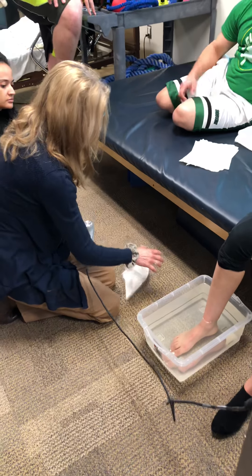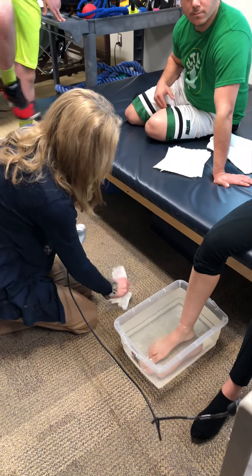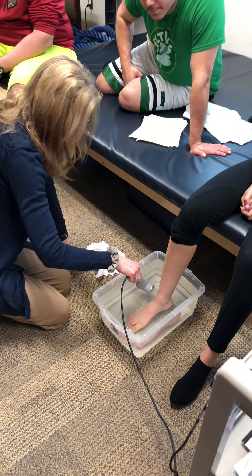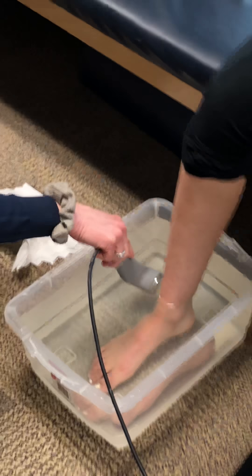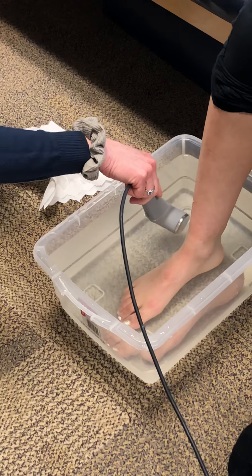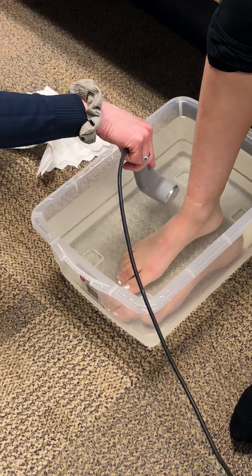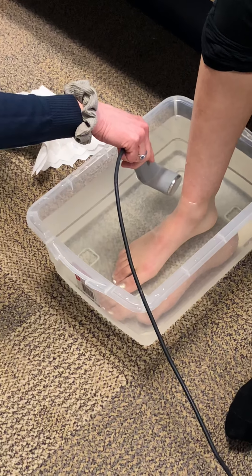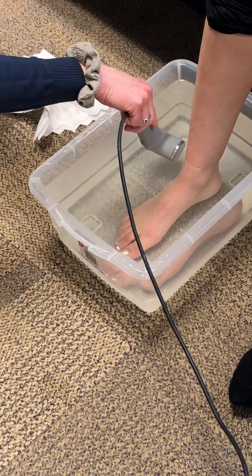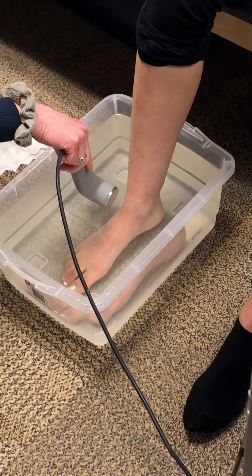What's the most common ligament laterally? ATFL. I would make sure I'm in contact with the medium and find exactly where the problem was. Hit start — is the timer going? Timer's going. I keep it around an inch or so away — on your test it says one to two inches — and I keep it moving. Sometimes people feel a tingling sensation, but it shouldn't be painful. I make sure it's in contact with the water the whole time. That's literally all you do. It's very easy.